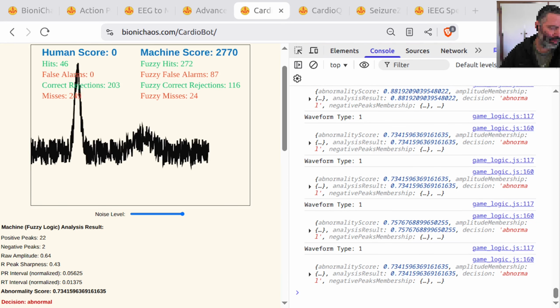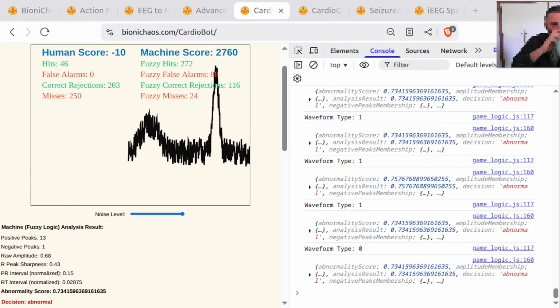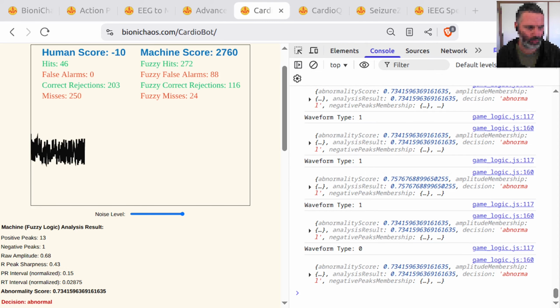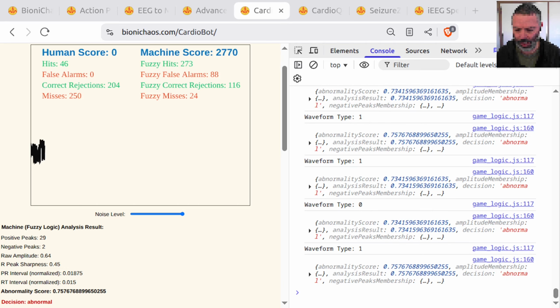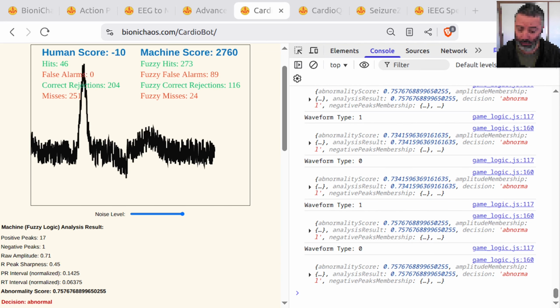Applying fuzzy logic to ECG signals is pretty clever. The idea is to deal with the inherent noise and variability in those signals. See, ECGs aren't always clean cut. There's a lot of fuzziness. Forget the noise. How would you use it to determine if the ECG waveform is normal or abnormal?